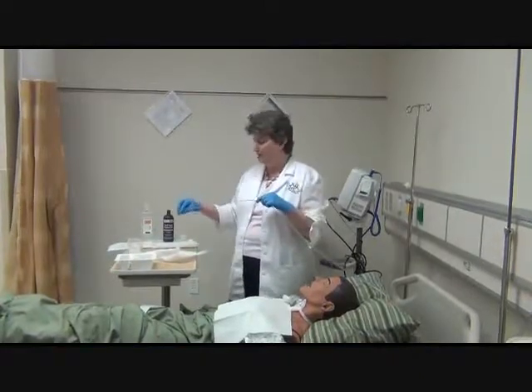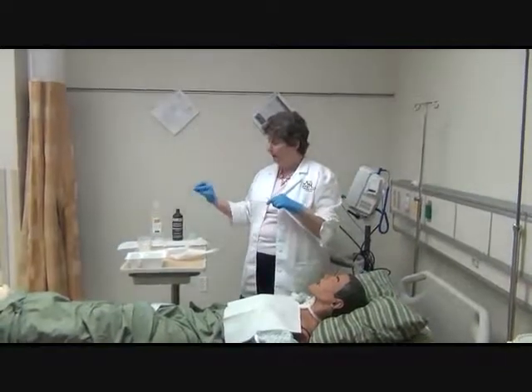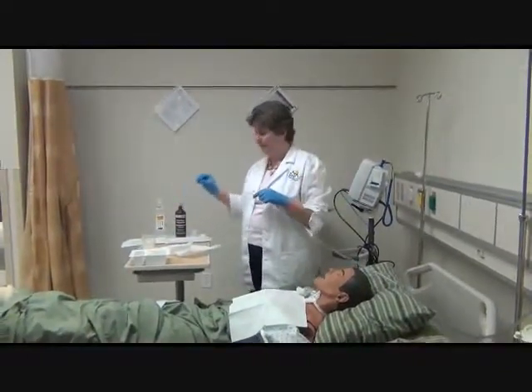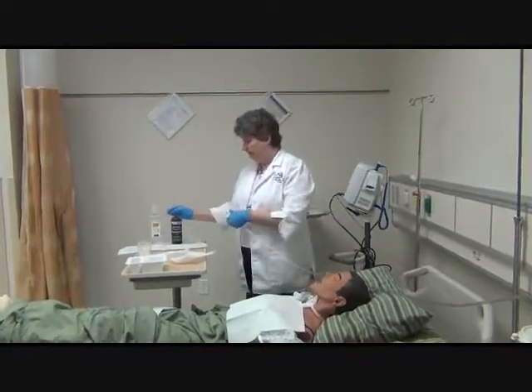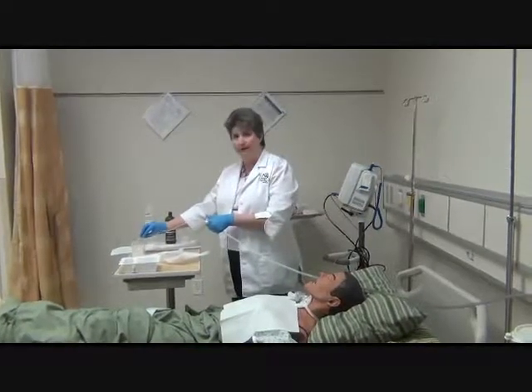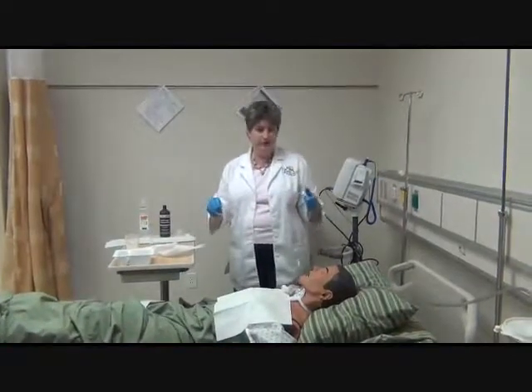I am no longer considering my glove holder a sterile field. If you're going to do that, you can put your bowl onto the sterile field and not take it off, but that's a little confusing, so until you're a little bit more experienced. So I'm going to reach over and suck up a little water. And it's going up the tubing, so I know my suction is working.